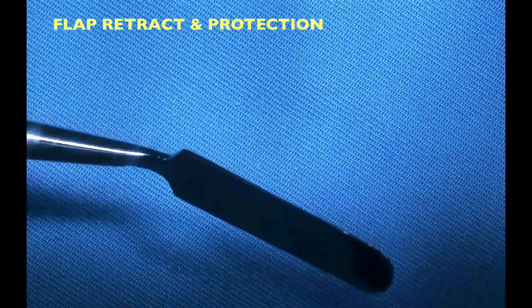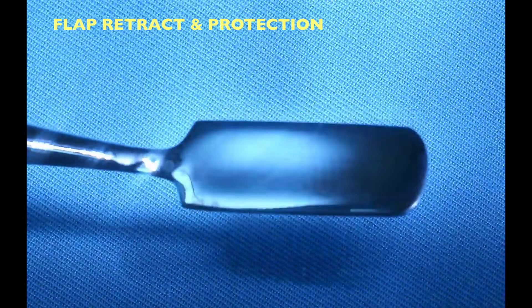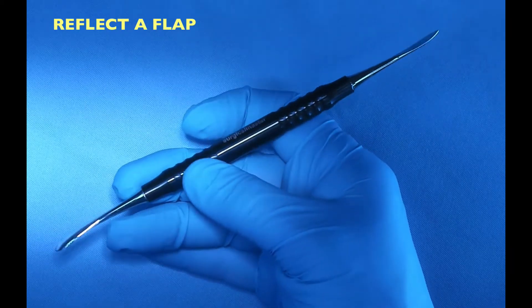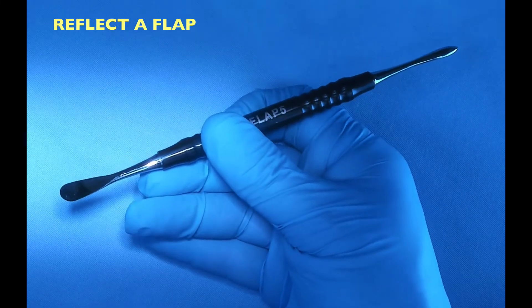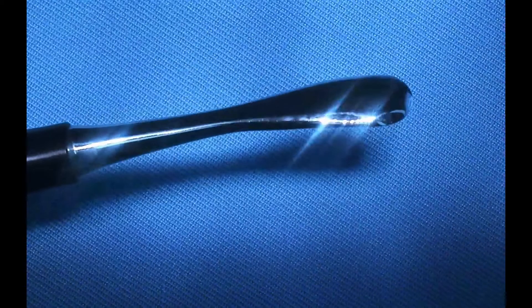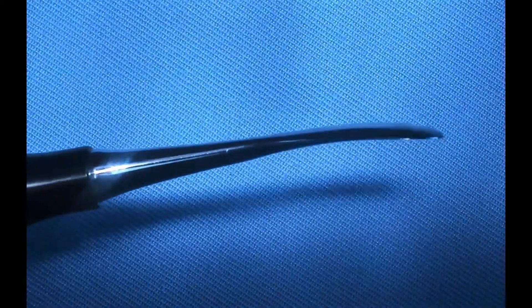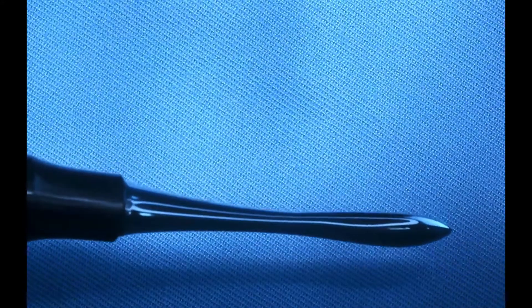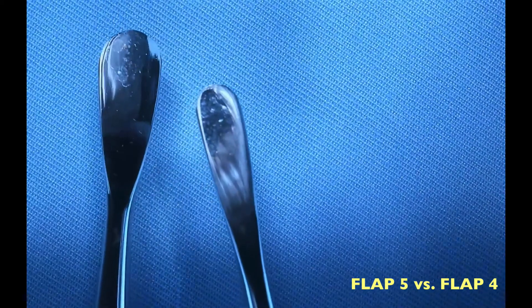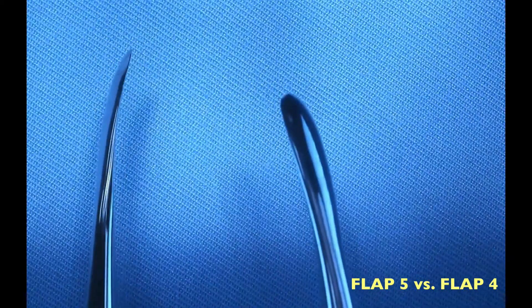The second type of periosteal elevator I recommend you have in the kit is the Molt 9. It has a sharp end and helps you undermine corners when you make vertical releasing incisions. Sometimes I use it for carrying bone into the site if needed. It's another type of periosteal elevator that comes in handy when dealing with areas that are harder to reach. It doesn't have the part that helps you retract the flap, but it's good to have a second periosteal elevator because sometimes your assistant will use the first one to retract the flap while you're doing a bony procedure.